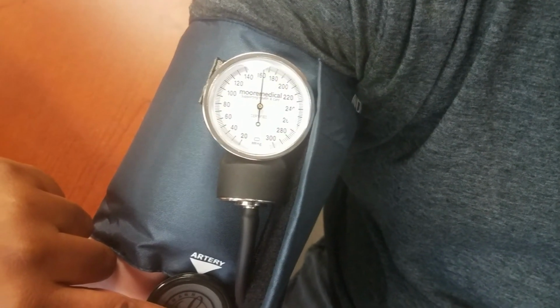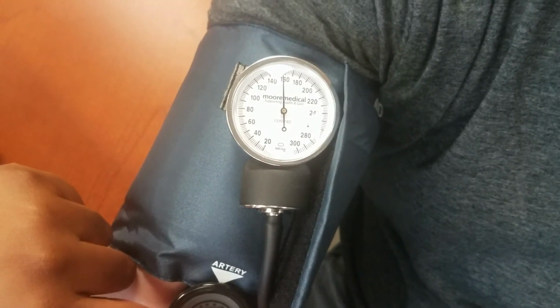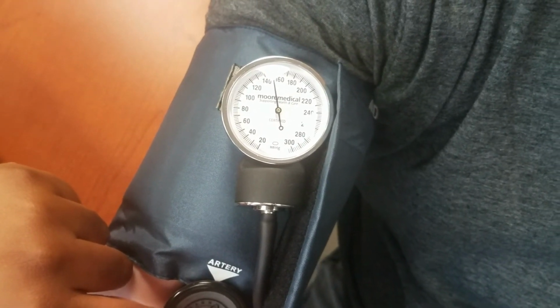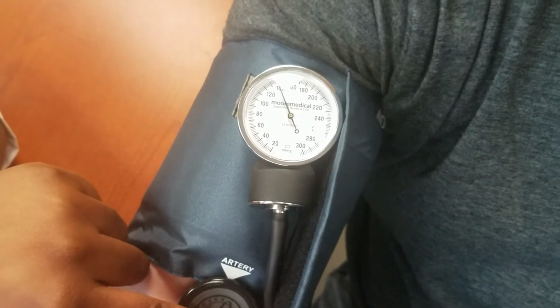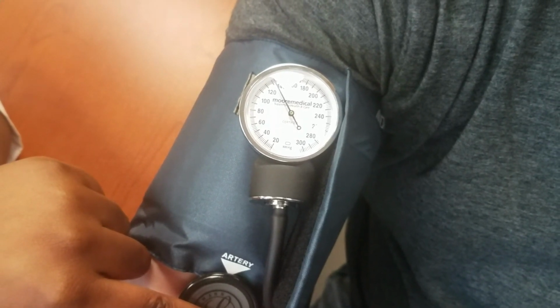Make sure you're in a proper position to be able to read the meter, or the gauge as it's often called, and deflate the gauge at a rate of 2 to 3 millimeters of mercury per second.